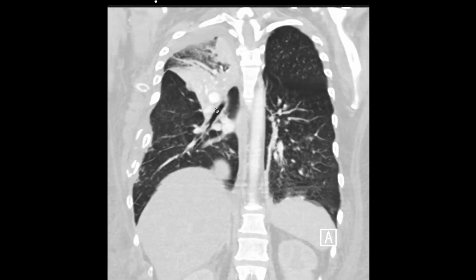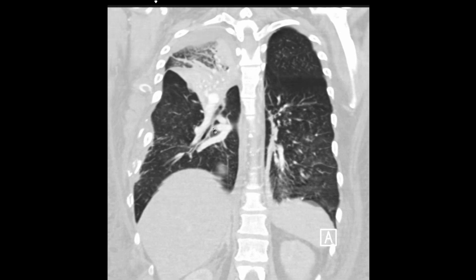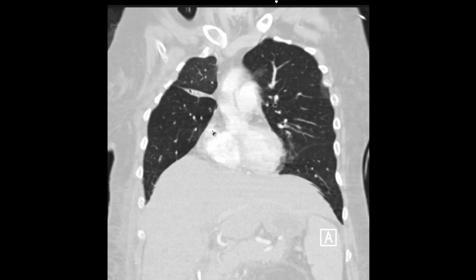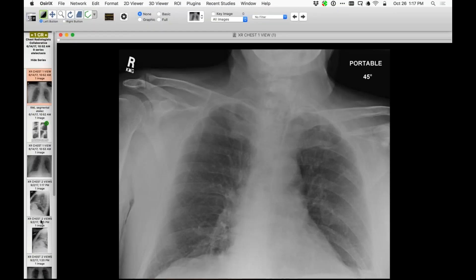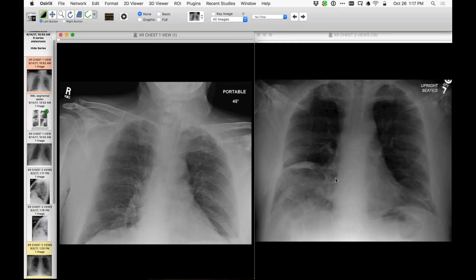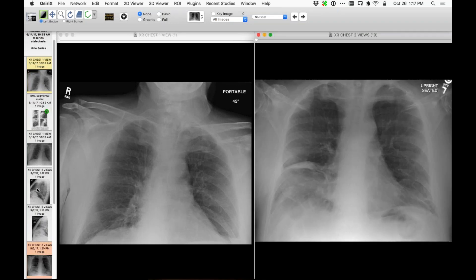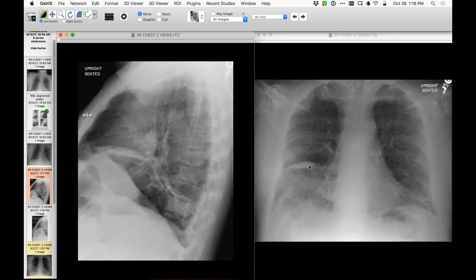Let me show you another interesting case of atelectasis. I saw this in a patient as an incidental finding. When I saw the patient, there is this opacity here on the frontal projection of the chest, and it's clearly new from a prior. Let me bring in the corresponding lateral projection. This is an opacity that involves the superior and lateral portion of the right middle lobe, but by appearance and location it's not typical of complete right middle lobe atelectasis. By location and appearance, it's very consistent with atelectasis involving just the lateral segment of the right middle lobe.